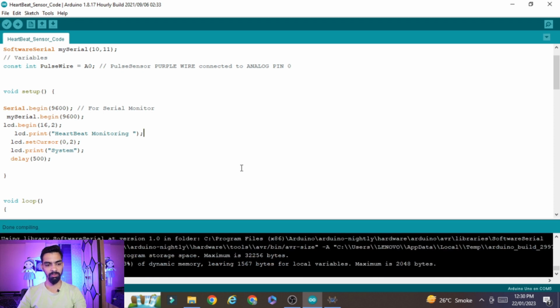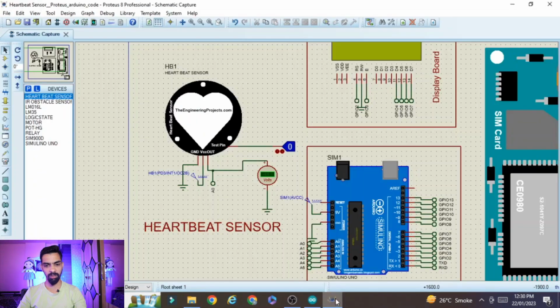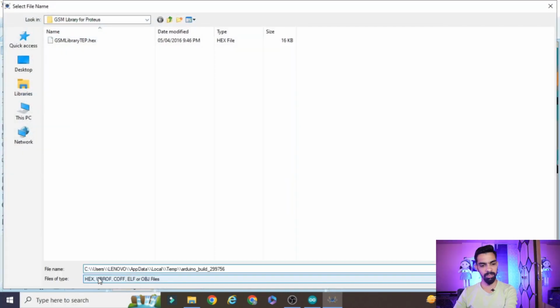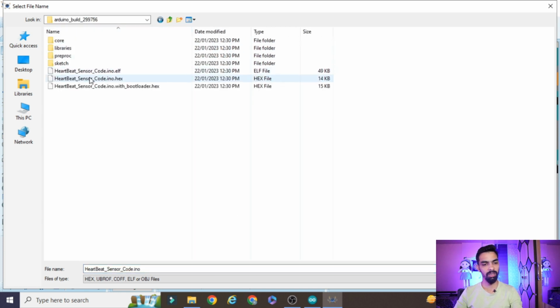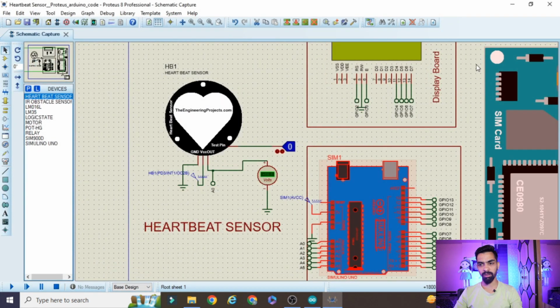Once you click on this Verify button, you can see at the end you will find the ELF file or hex file path. Copy this path completely. Then go to Proteus, double click on this Arduino, click on this folder and paste that path here, and remove one backslash. Then press Enter, and you will see the hex file. Click on this hex file, click on the Open button and click on OK. Then after that the project is completed.